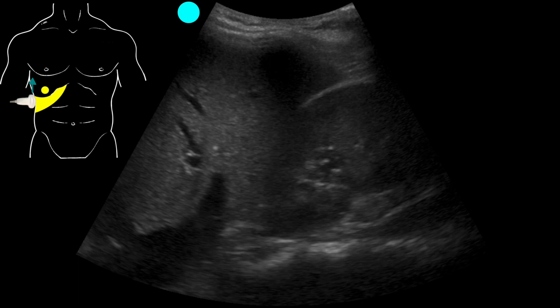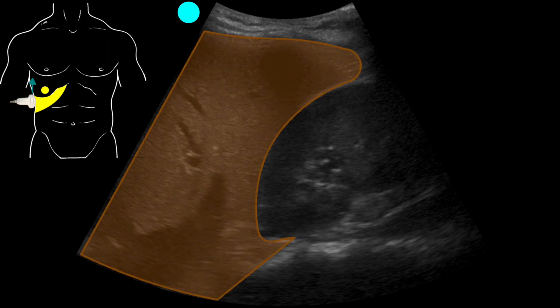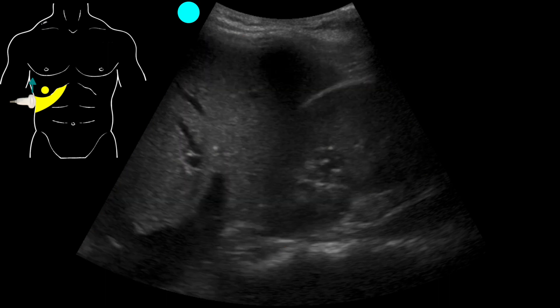Since we've seen free fluid in other views, we want to evaluate for significant free fluid, so we look in the right upper quadrant — similar to an E-FAST exam — with the probe marker towards the patient's head, scanning roughly in the mid-axillary line around the 8th to 11th intercostal space. We identify the liver and the kidney and look for any anechoic stripes in Morrison's pouch or at the inferior tip of the liver, which is absent here.